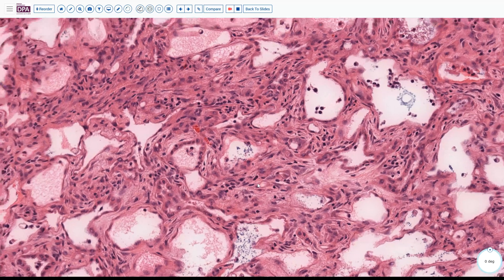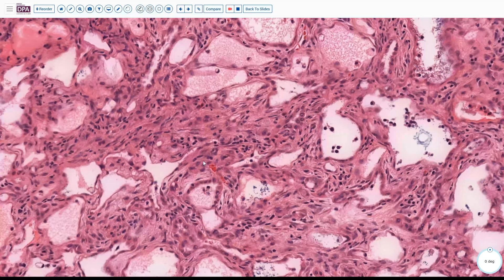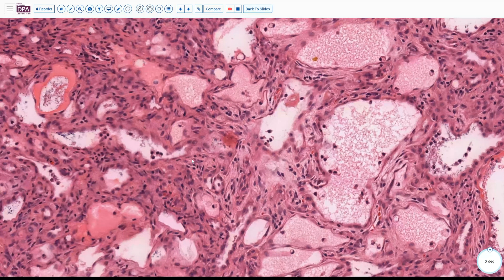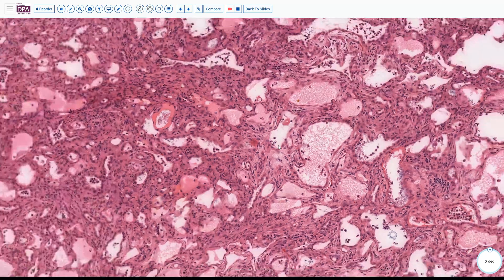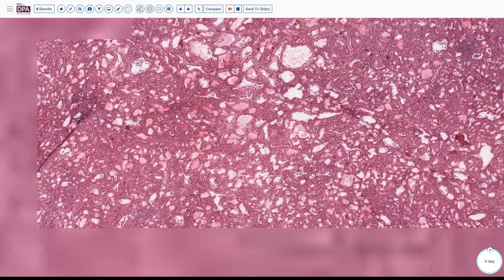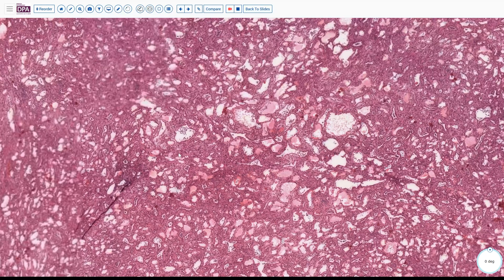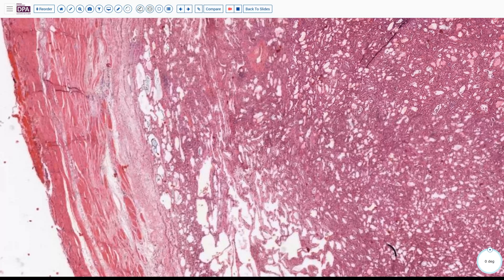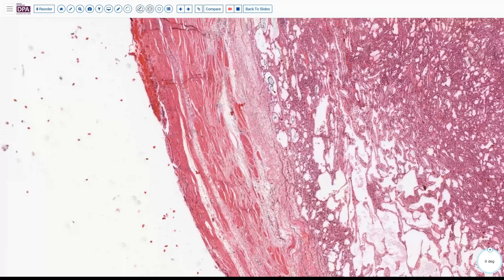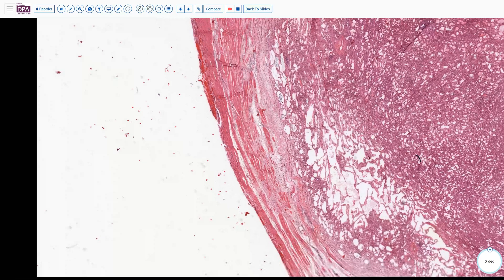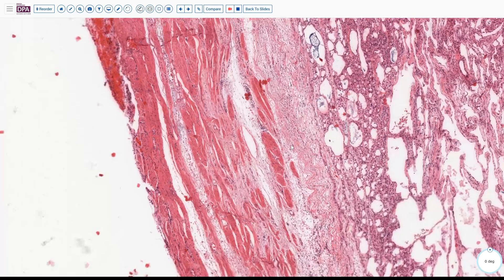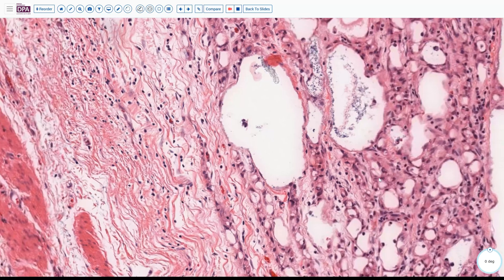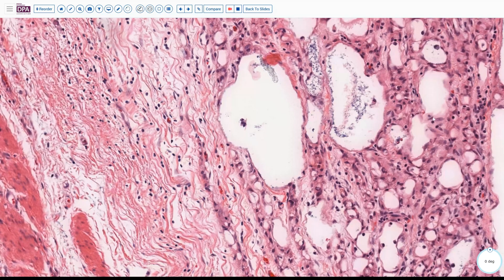As we look around, we don't see too much in the way of atypia, although here there's maybe a slightly enlarged cell or two. So it's a gland or pseudogland-forming lesion with some luminal type of secretion or luminal contents and intervening fibrous stroma. If we go out to the periphery of this lesion, we can look at the margins. It's fairly sharply circumscribed, but not encapsulated. Here we can see the border with the surrounding myometrium — not particularly infiltrated, a little bit of space here, and we see this pattern of some cellularity, maybe even a few almost clear or vacuolated cells in the backdrop.